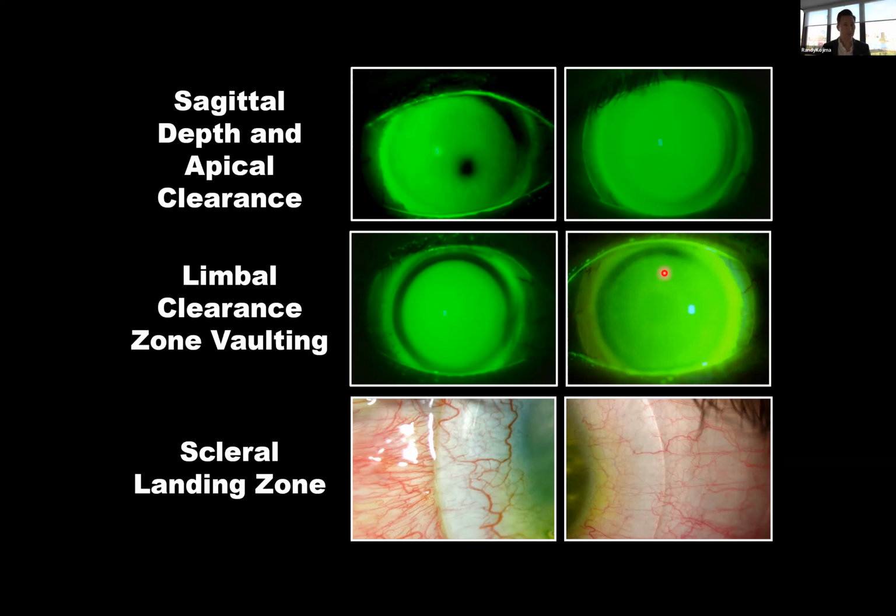The Smart Lens team can share with you some of the tricks to confirming whether you have a lens in bearing with the surface or that it's just a thinner pattern. If you have more than 180 degrees of thinning or touch, that's when I would lift the limbal lift zone, the 3rd zone, by 4 to 5 steps to ensure that we're clearing and protecting the tissue.